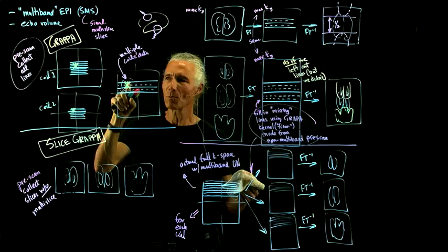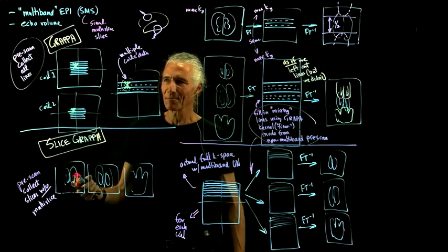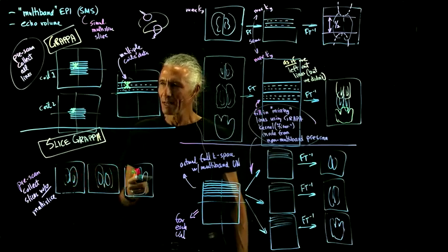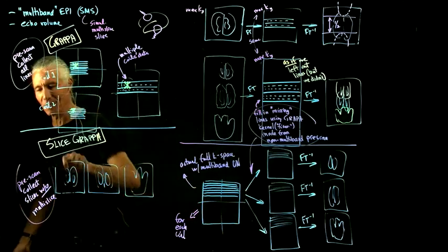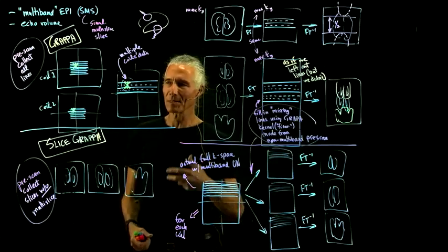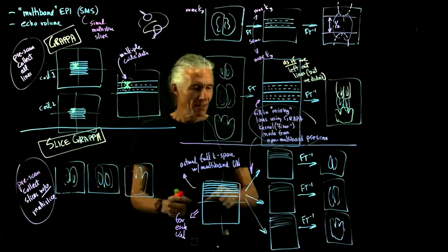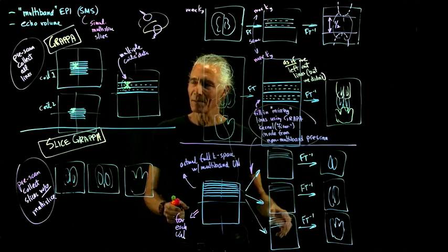So one thing to worry about is, what if something screwed up, like the unruly 4-year-old in the scanner jerked his head around right during the collection of this pre-scan, where you collected the data without the multiband multiple slice on? Well, since that is used to generate every single other image in your later data set, all the 8 minutes of images afterwards, it's going to screw them up too.